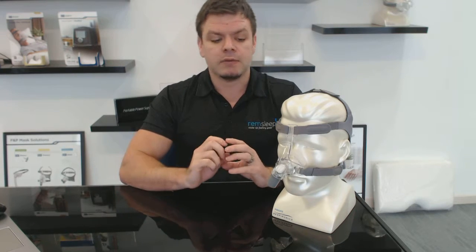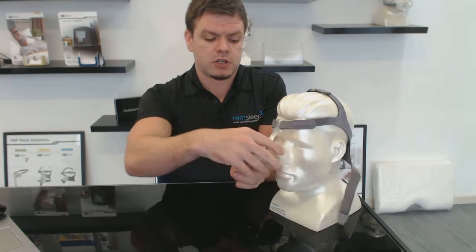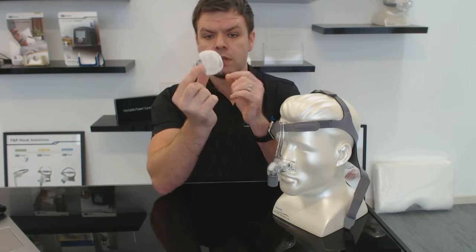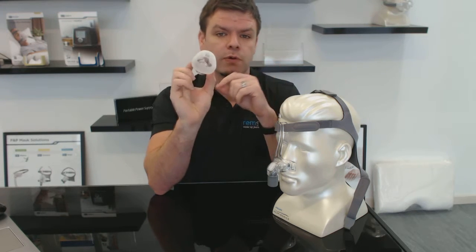Another great thing about this mask is that it seems to seal really really well. Being a sleep scientist and fitting a lot of masks, you soon develop an understanding of which masks seal really well and which masks don't — and this one does. I'll take it off and show you this section here — this is the part that goes on the nose. Fisher & Paykel have developed a really good seal here; it holds the air in well and it doesn't leak.